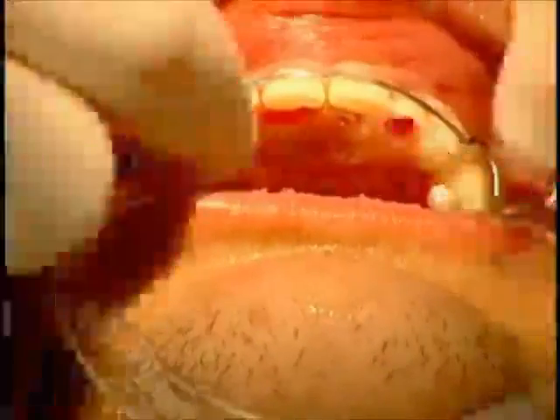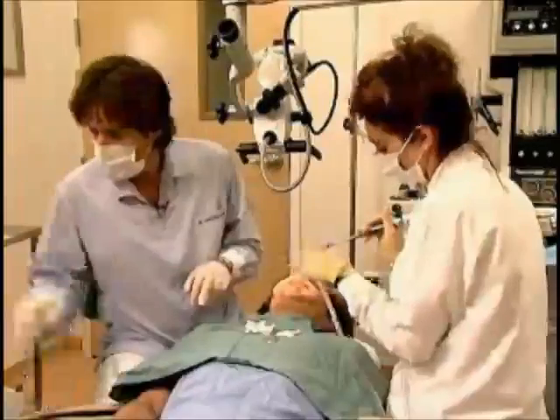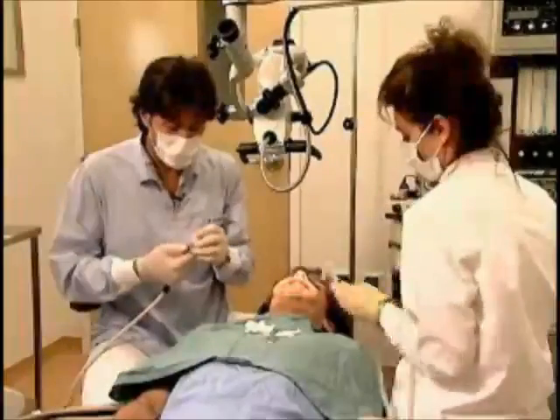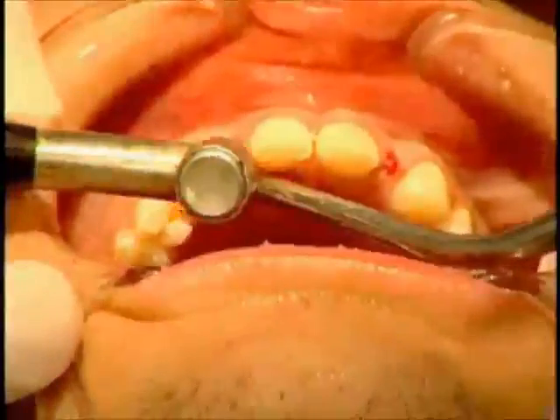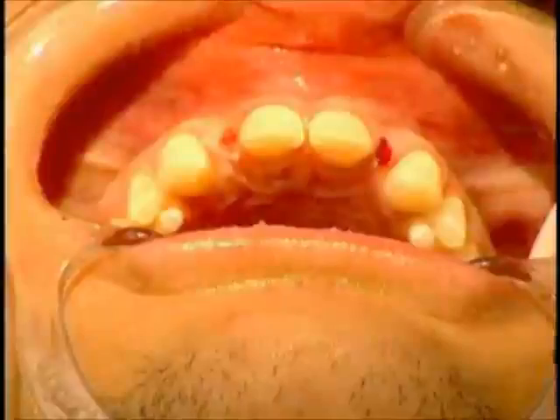And we're going to go ahead and evaluate those purchase points. You can suction in both spots. What we're going to do as well is go ahead and open up the original access points to the location of the implants. And this is where the implants are going to be placed. We're going to go ahead and just open up these holes. Alan, go right there?